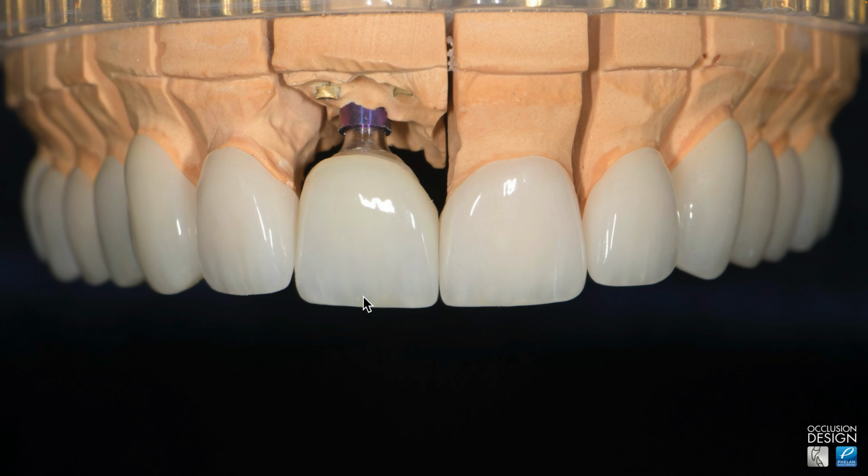So we had to make a 2-piece, which I don't love. I'd rather do a 1-piece with a screw, but especially when it's shallow like this. But this is what we had to do. This crown is close to where we expected the veneer final color would be. It's not 100% perfect. We thought about sending it back, but we decided to keep it and cement it.